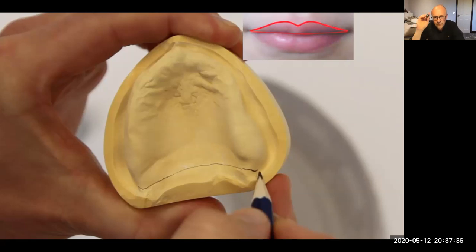And I think of, in my mind, when I'm doing this, the Cupid's bow. Can you see I've just put some lips here and this lovely Cupid's bow shape to this. So this is what I do. This is a definitive model here. Can you see that this is an imprint of the old denture where the post dam is short? And I'm bringing it further back here because I want maximum suction on it.